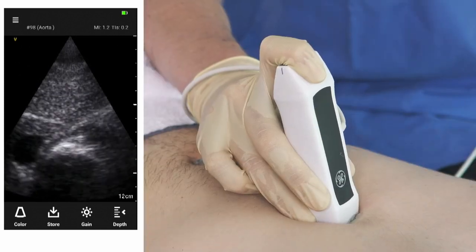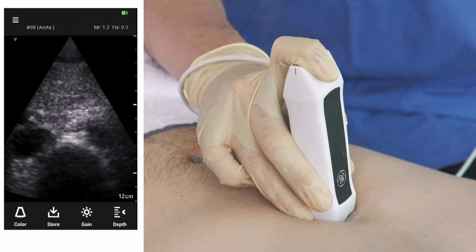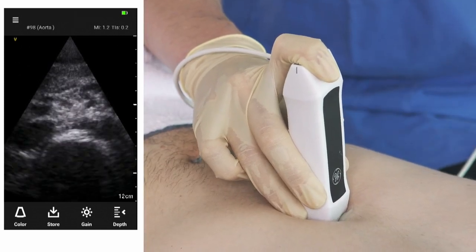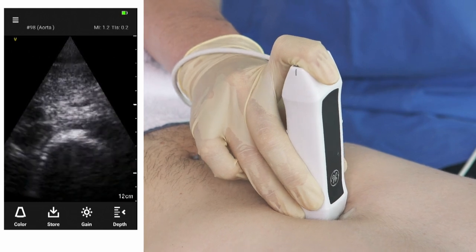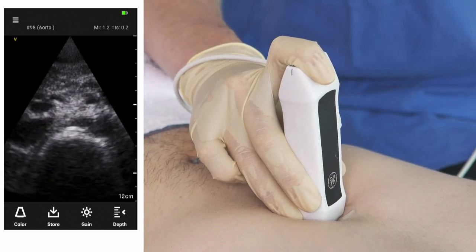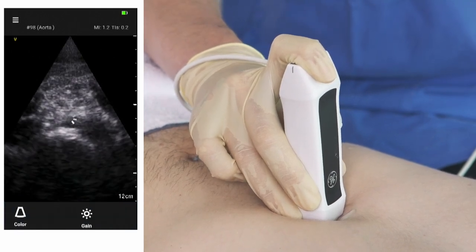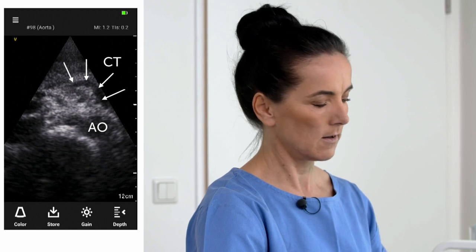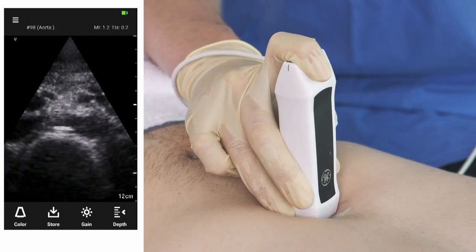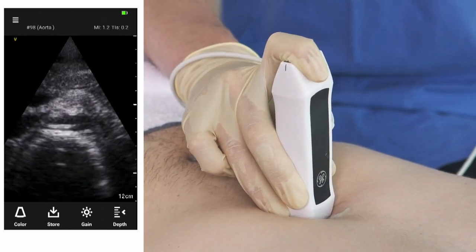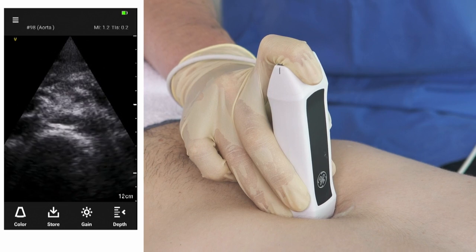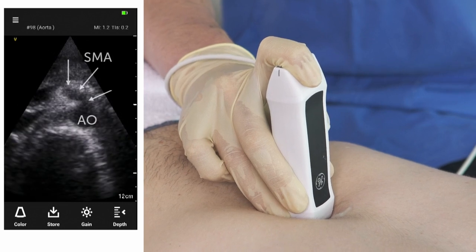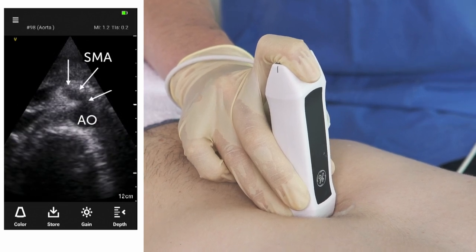Starting here at the xyphoid area, we slowly move the transducer in the transverse direction more caudally. The first vessel leaving the aorta is the celiac trunk. Moving even more caudally, the next vessel you can appreciate is the superior mesenteric artery.